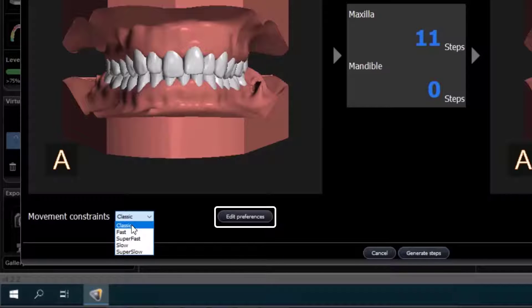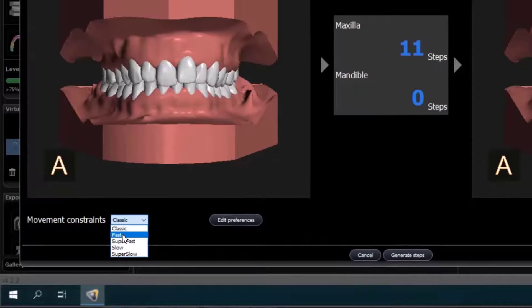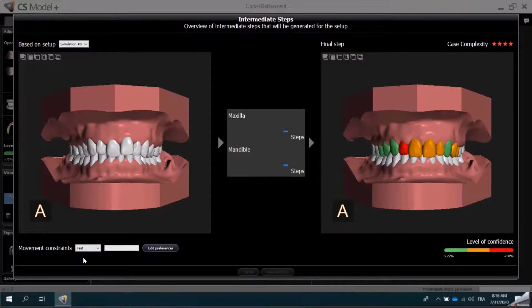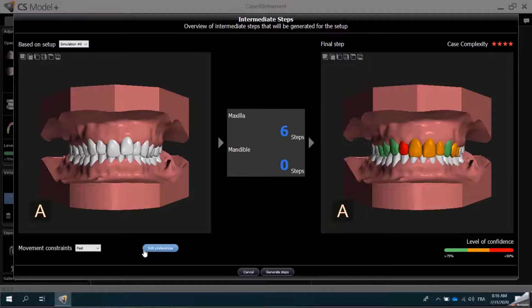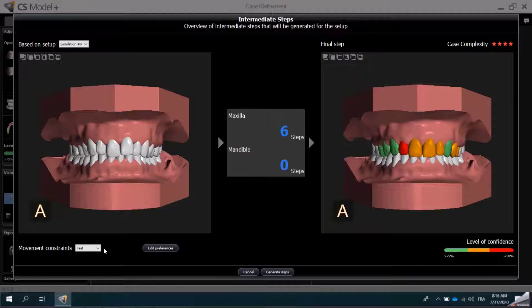You can define and name your preferred movement constraints in the Preferences. If I click on Fast, the software will recalculate the number of steps and will complete the treatment in just six steps. I will revert back to the Classic mode for this example.